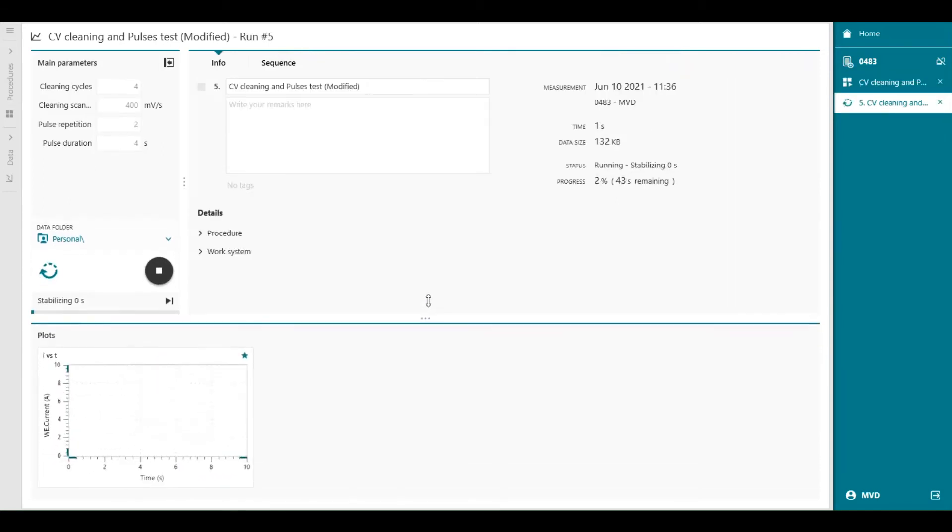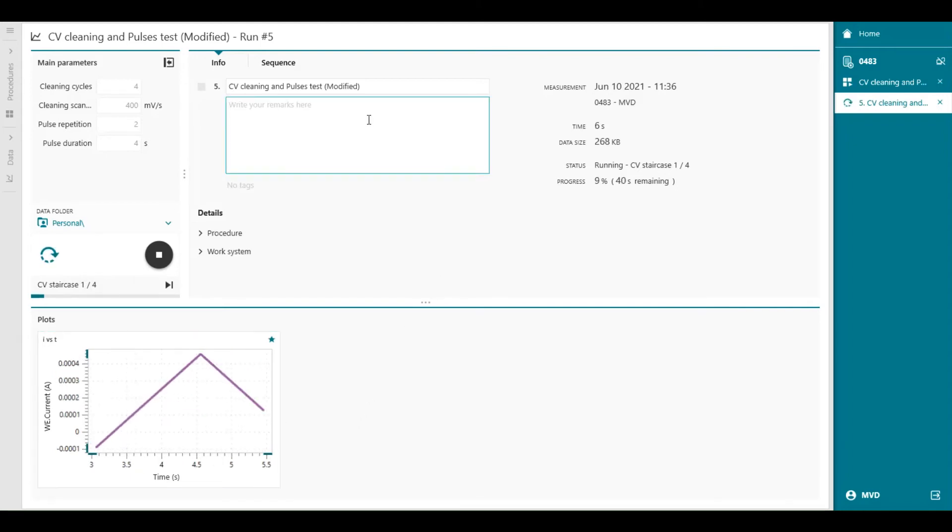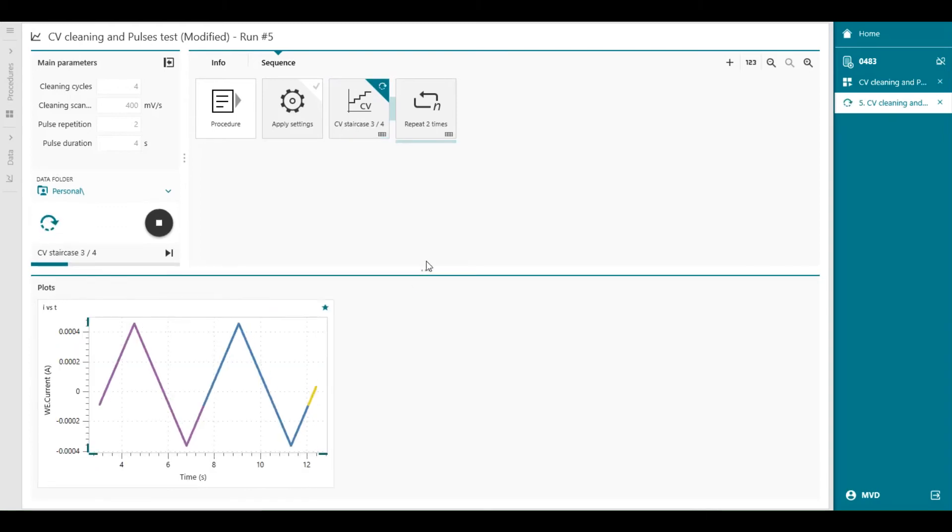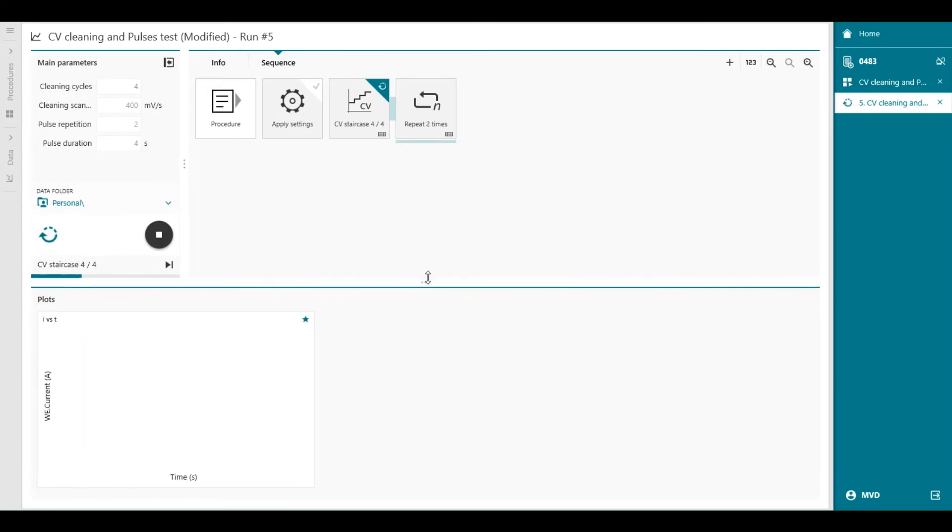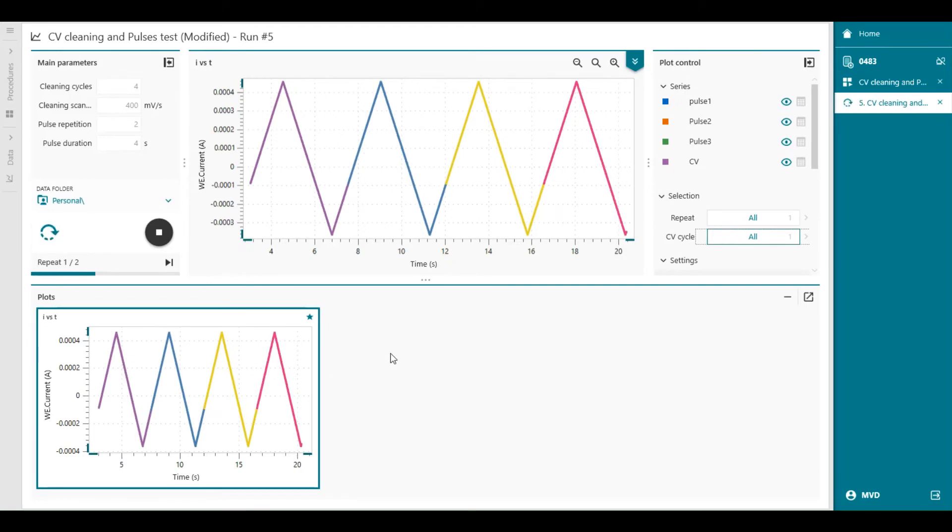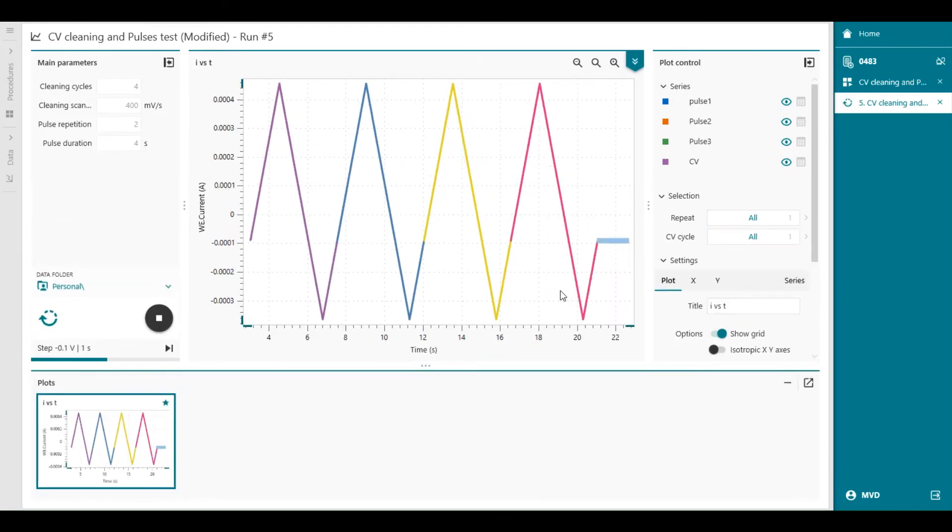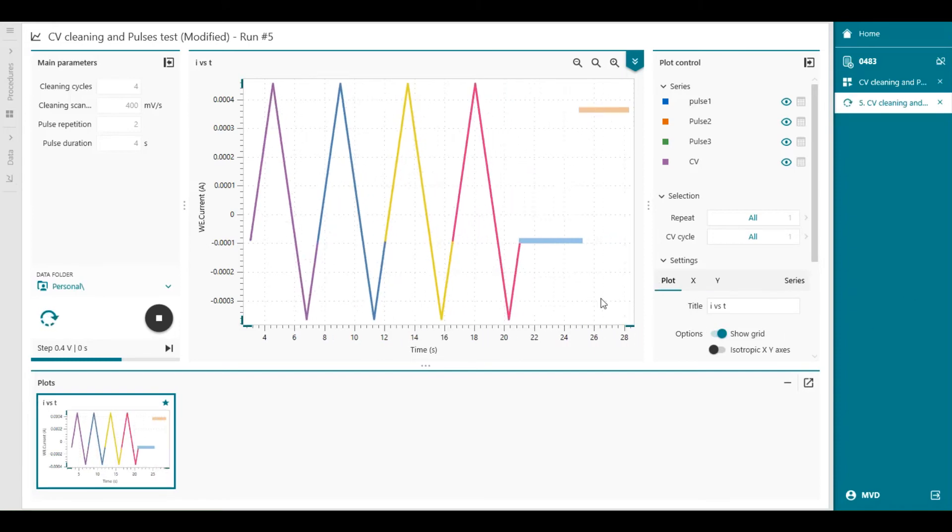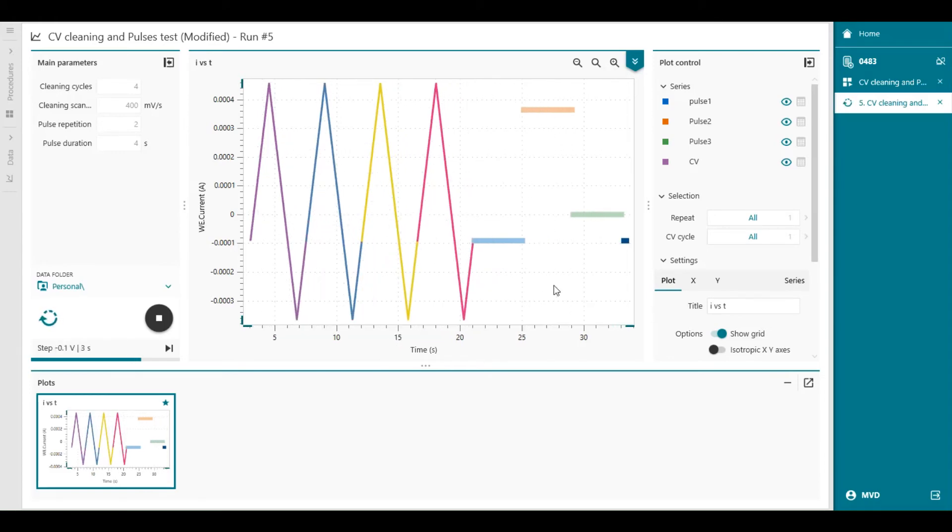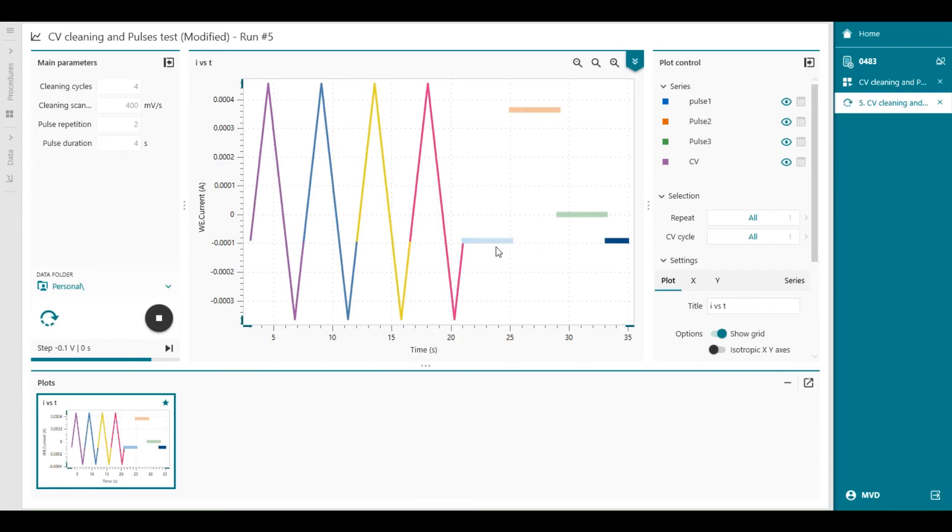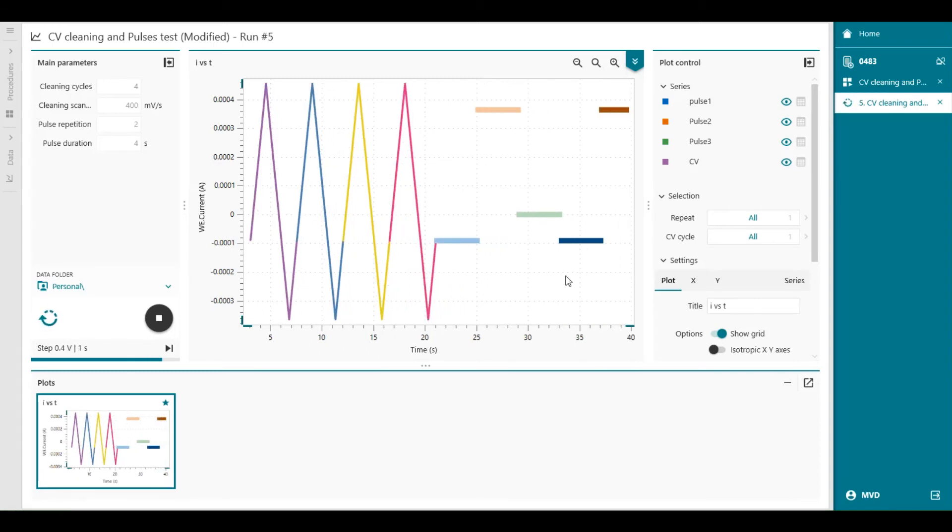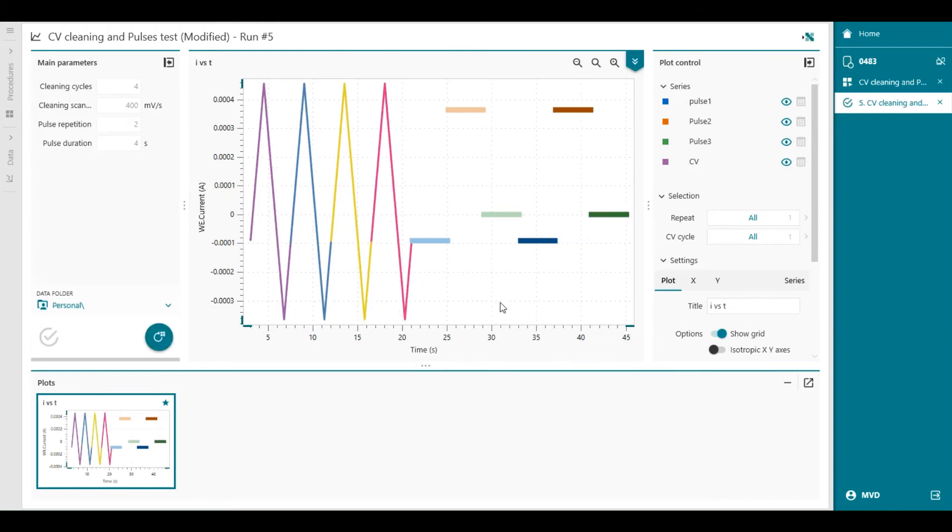The measurement is starting. You see the CV scan appearing. You can also follow the sequence. So the second scan, the third scan. And we can follow what's going on in the graph. You can also double click on the graph if you want to enlarge it. And the pulses are applied. You see that each scan has a different color. And the same counts for the repetitions. The measurement is finished.